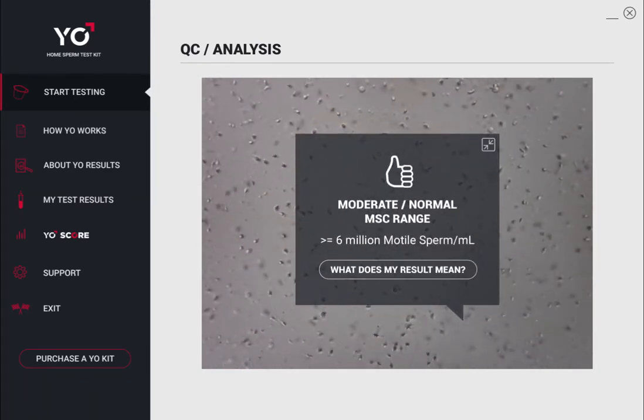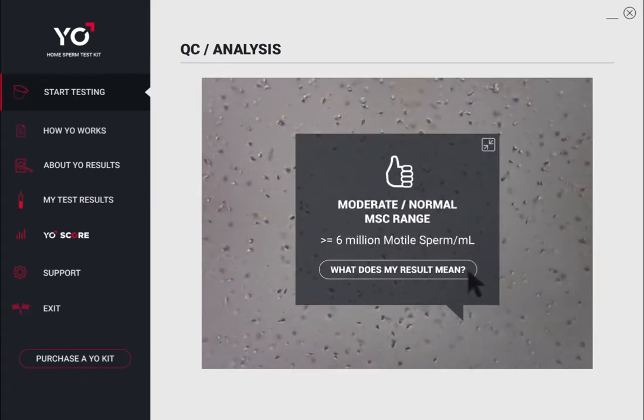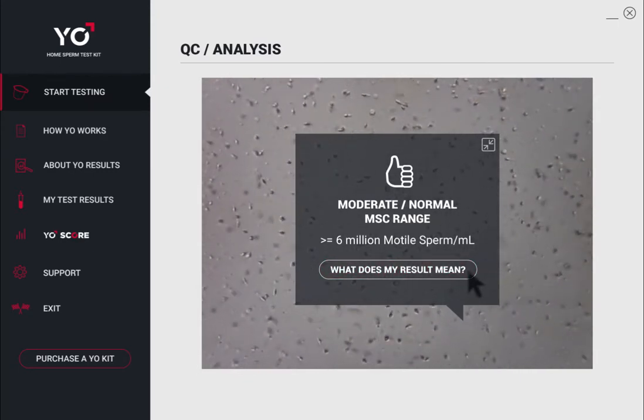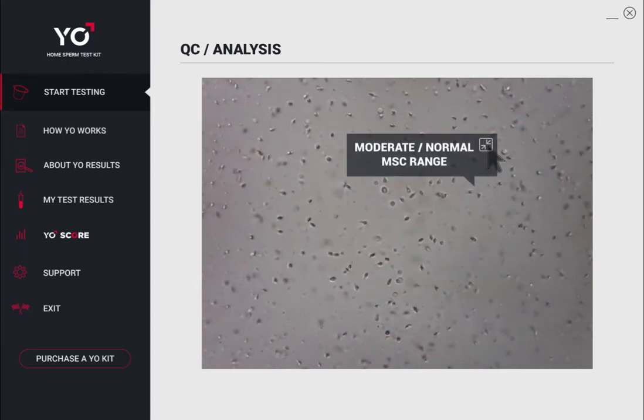To find out more about your results, click What Does It Mean? View your swimmers in action in full screen by clicking the minimize button.